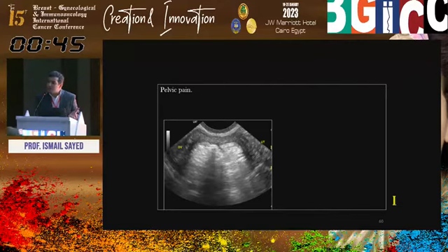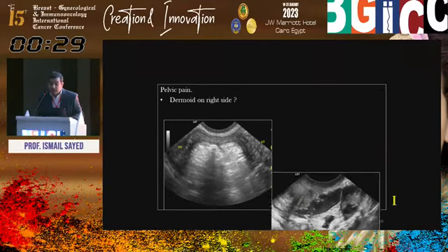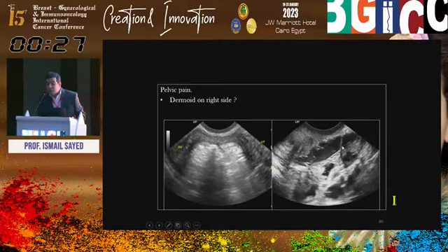Maybe dermoid? Yes or no? I don't suggest dermoid because I see the ovary itself. It's extra ovarian. What about this structure? Maybe thickened tube. Other adnexa, what about this tubular structure? Hydrosalpinx, very good. I'm happy to hear this mistake.